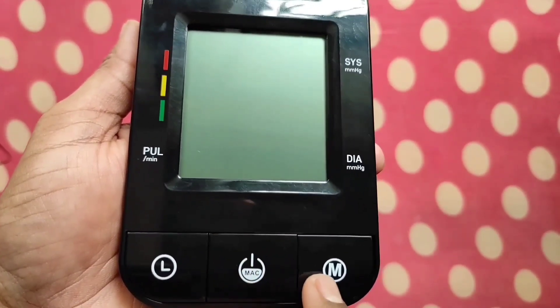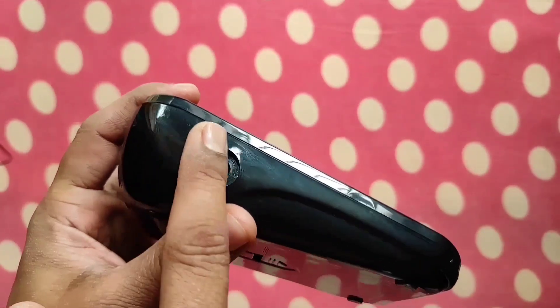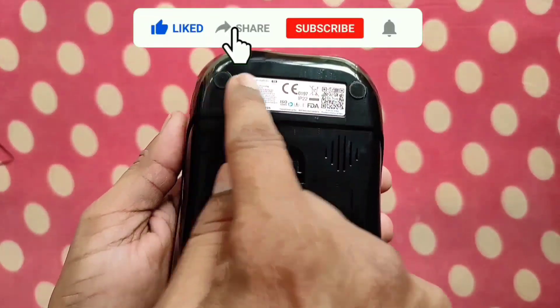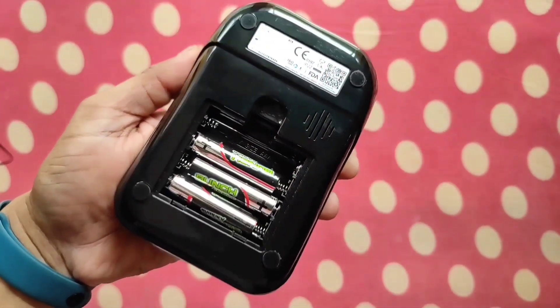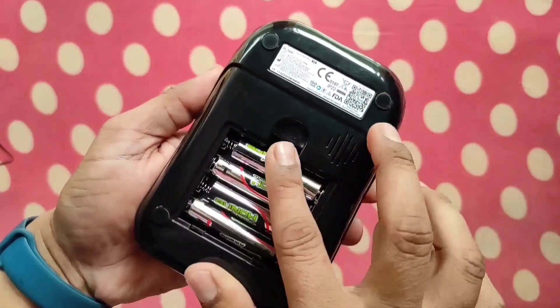This is the memory button. Here you can see the air outlet where you have to insert the air connector, and this is the USB port. The bottom side of the BP monitor contains 4 rubber pads at the 4 corners, and one battery compartment where you have to insert 4 AAA size batteries, which are included in the box by the company.